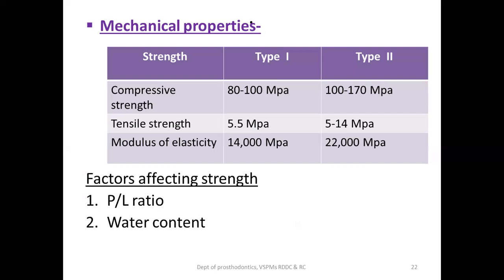For that, you should always keep the lid of the liquid bottle closed. And when you are mixing, just before that, you have to dispense the liquid to avoid absorption or evaporation of the water content of the liquid. Because otherwise, it will affect the strength of your set cement.